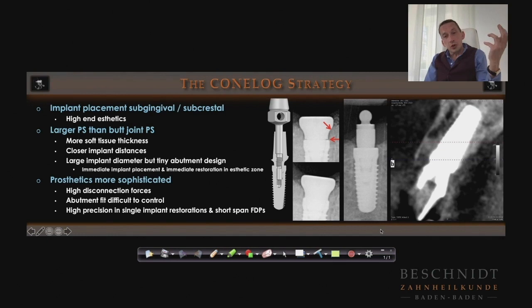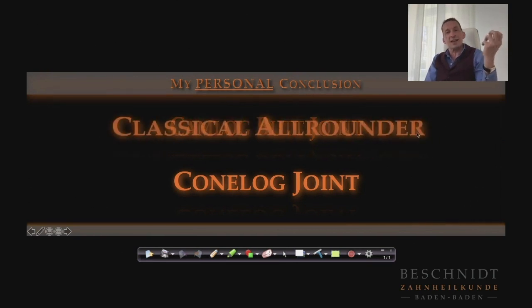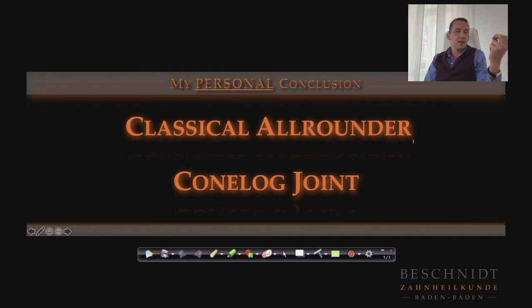So, to conclude finally, in my personal opinion, the Camlog butt joint connection is the classical all-rounder. You can use it with platform switching, without platform switching. It's very easy for the prosthodontist and also for the dental technician. The Camlog system still has its place in implantology.